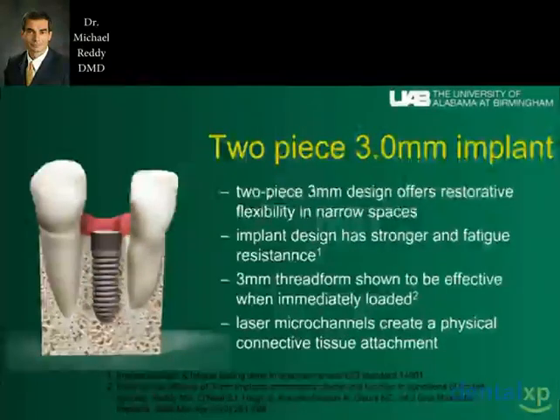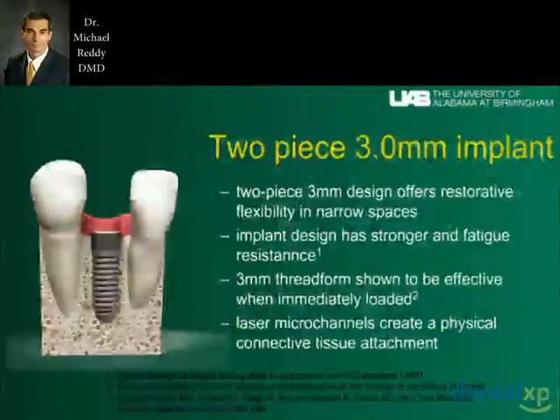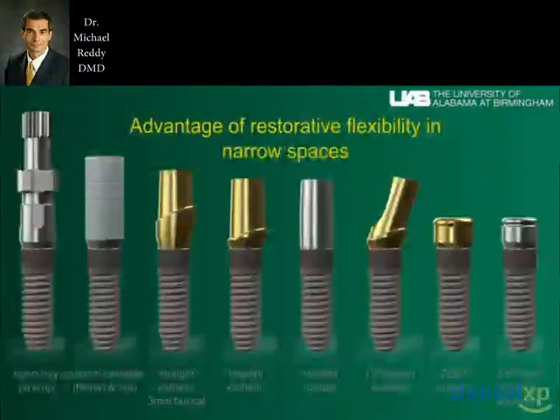And the main improvement is the prosthetic design. The second significant improvement with this implant is that now there is laser ablation, or microchannels, cut into the top. So there's no longer that machined area in a transition zone, but now there's an oriented, roughened surface with this laser lock surface that the bone and the soft tissue like to adhere to.